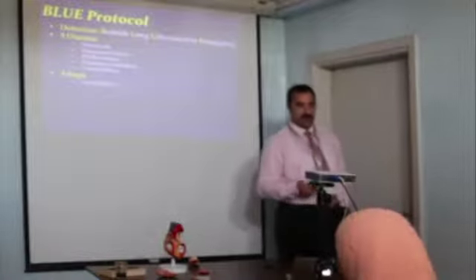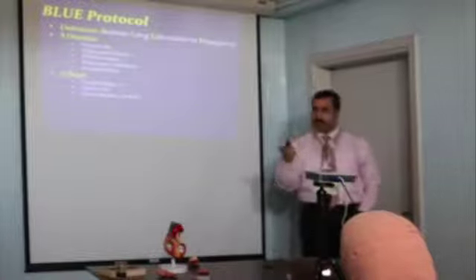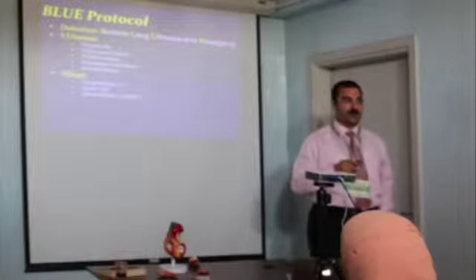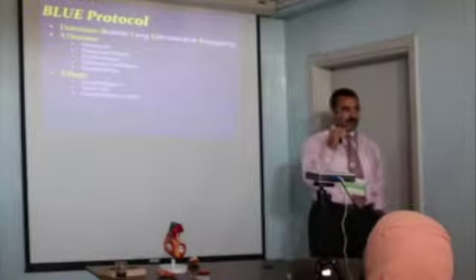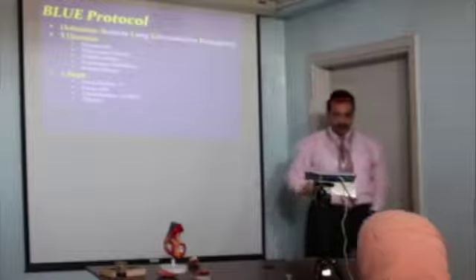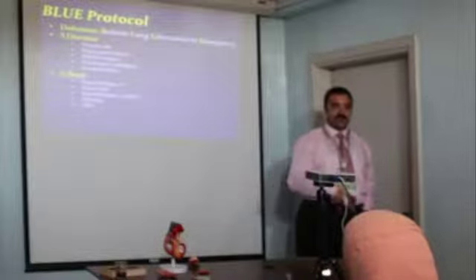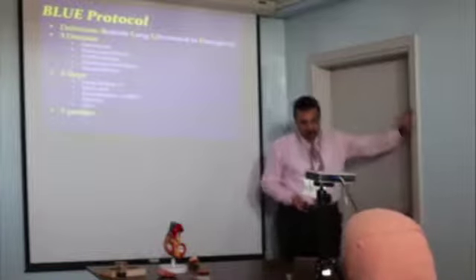What are the steps? Check for lung sliding, A lines and B lines, lung point. If you have an A profile, B profile, or C profile, what's the difference between A, B, and C profiles? Anybody remember that? What is C profile? It's B lines, a modified B lines, okay, with shredded pleura. So it is an indicator of pneumonia. Pleural effusions are very easy to diagnose. If you have a DVT in your patient and A lines, so your lung tissue is healthy, your saturation is 80%, you have a DVT, it's a PE. Simple as such. Okay? So we have seven profiles in our BLUE protocol.